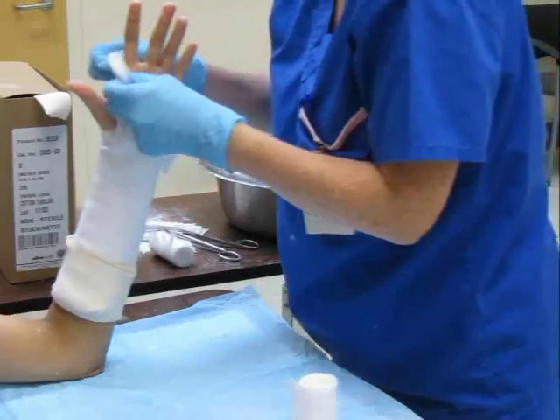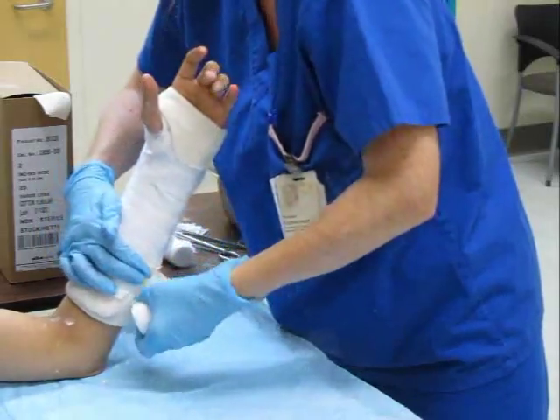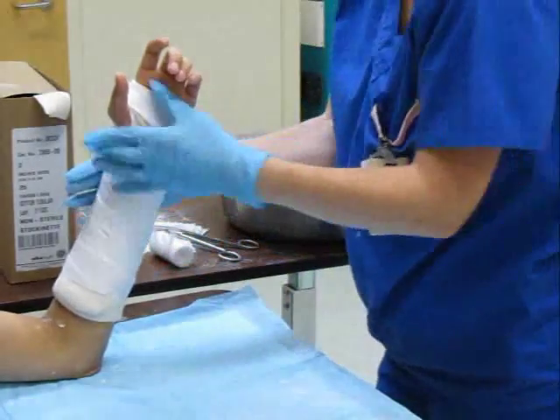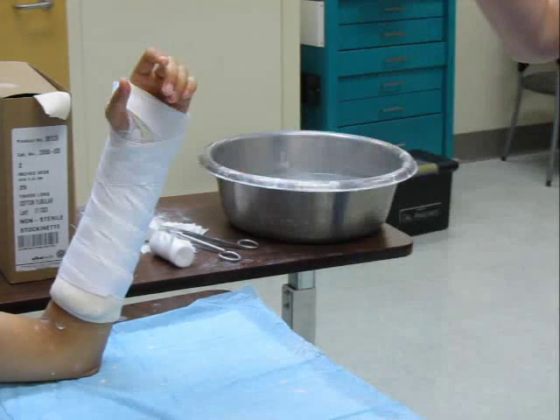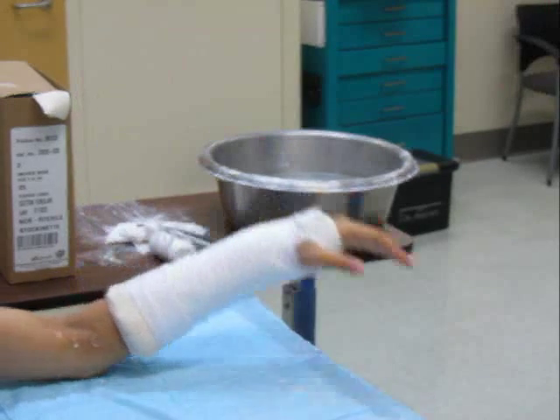Fold over stockinette proximally and distally. Finish the splint with a second layer of flannel wrapped in the same manner as previously. Mold the plaster to set in the desired position as dictated by the injury. The finished cast should allow excellent movement at the metacarpophalangeal joints, base of the thumb, and the elbow.